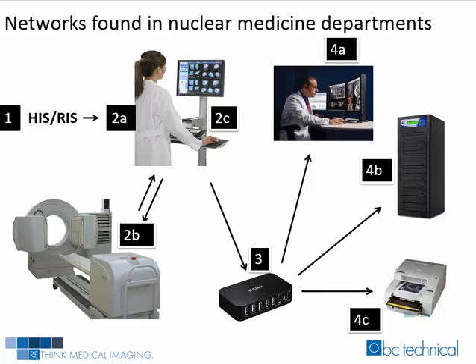This is a typical nuclear medicine camera room network. We have listed each part of the network with a letter and will explain their role in the workflow. HIS-RIS stands for Hospital Information System or Radiology Information System. They each mean the same thing.